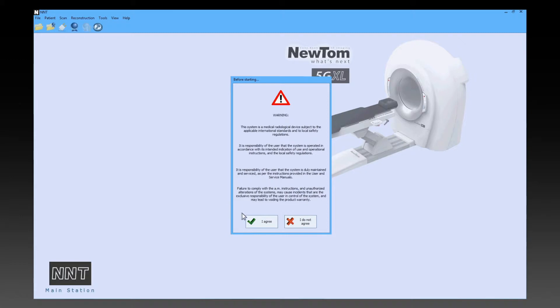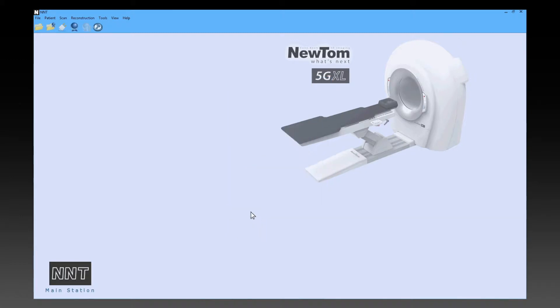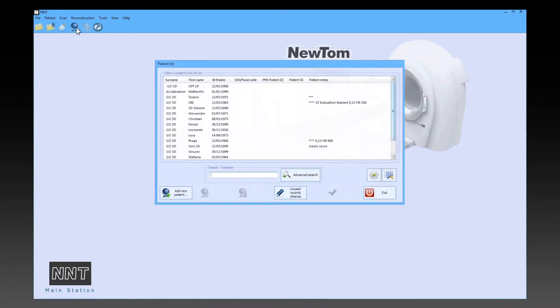After welcoming a patient, her folder can be retrieved from the patient records or a new entry can be made from the special screen page.